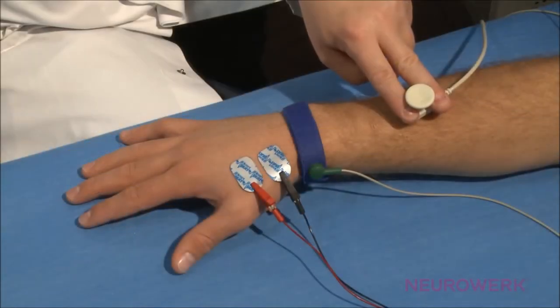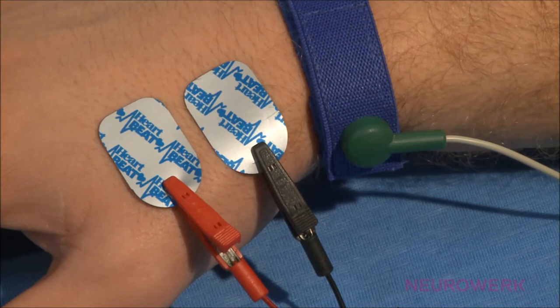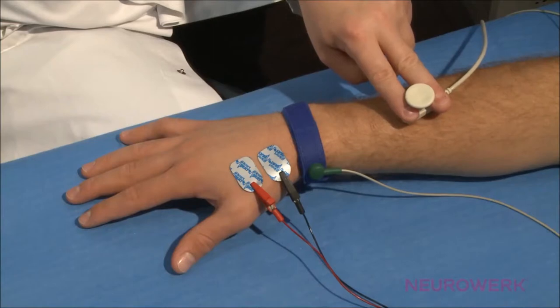The adhesive electrodes are placed on the back of the hand between the thumb and the forefinger. Alternatively, a bar electrode or ring electrode can be used for recording. The ground electrode is placed between the stimulation and recording electrode.